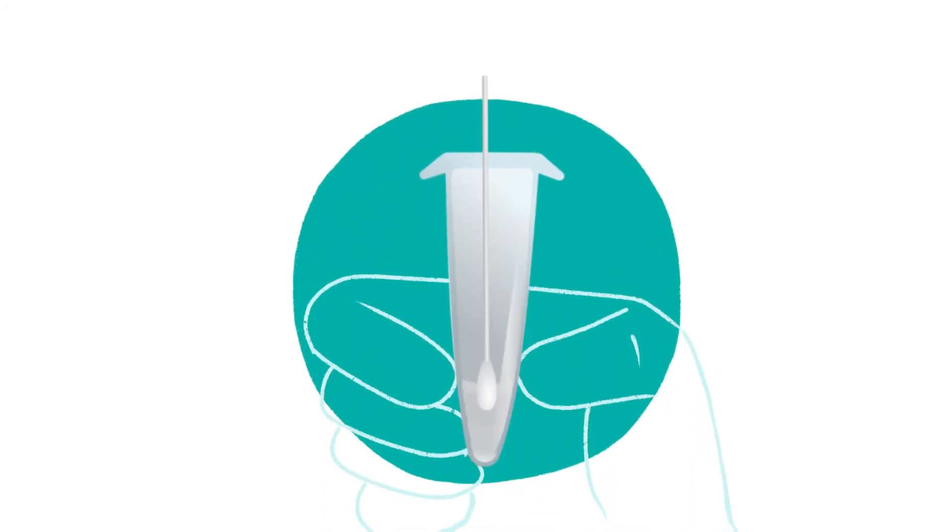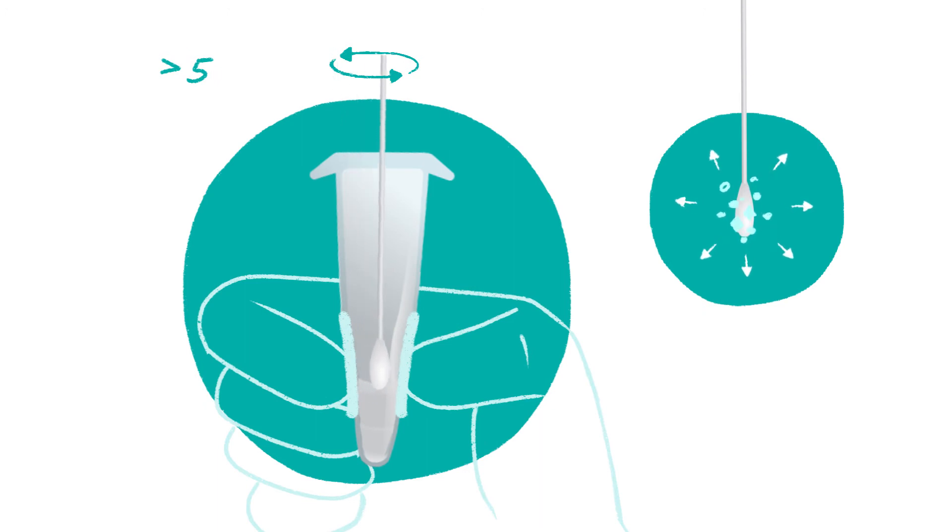Place the swab into the buffer vial and rotate to stir the swab vigorously at least five times. Further rotate to stir the swab another five times while squeezing the sides of the buffer vial.